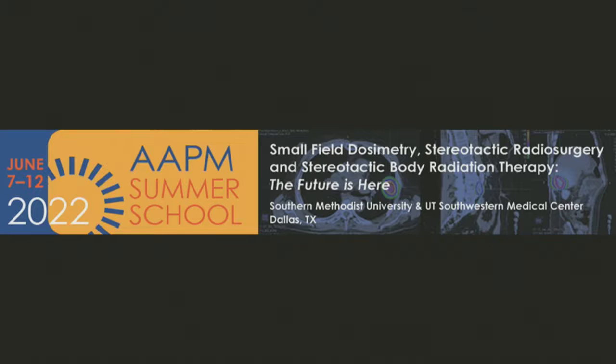There are some metrics that algorithms will bring, like the Jacobian. There are some metrics that we look at when we do deformable image registration. But again, I think it's an area that, like I said at the end, really needs more work to understand the uncertainty. We don't have a ground truth, right? That's the problem with deformable image registration. And I don't think there is a good method. There is TG132 that reports on all these and QA methods to use. There are publicly available data sets that are fiducial based.